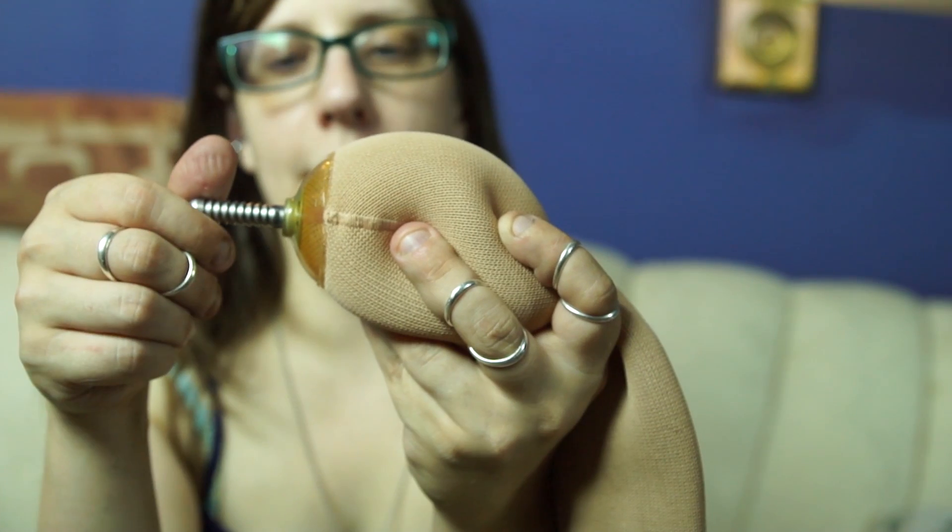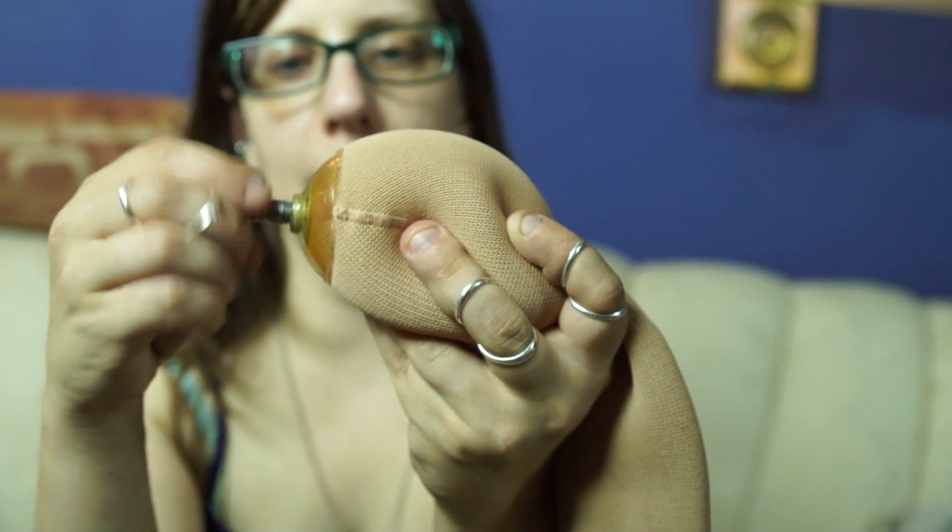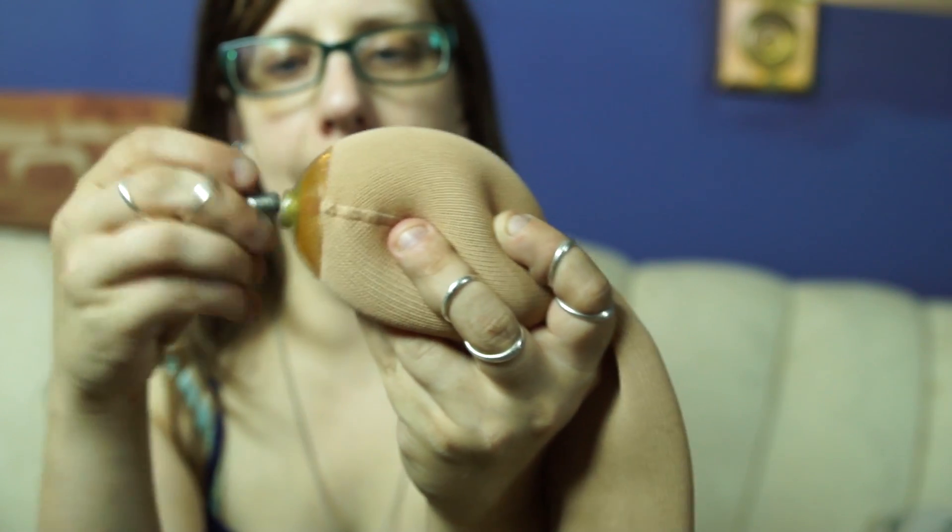This is a Silo liner. It's made by Silipos. Here you can see how the pin comes unscrewed from the umbrella of the liner.